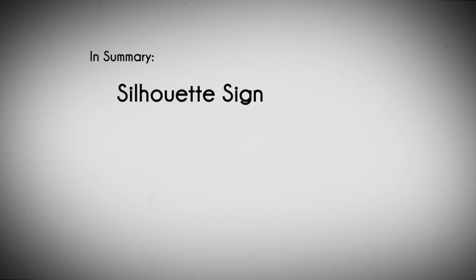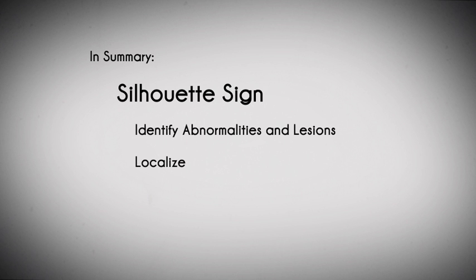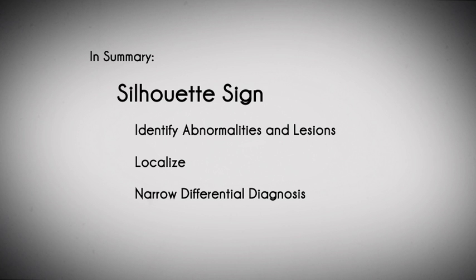In summary, the silhouette sign should help to both identify abnormalities and lesions, as well as to localize them. Once the lesion is correctly localized — for example, mediastinum versus lung parenchyma versus pleural space — the differential diagnosis can be narrowed down to a more specific subset. In this module, we were able to identify and localize two anterior mediastinal tumors and a right middle lobe pneumonia.